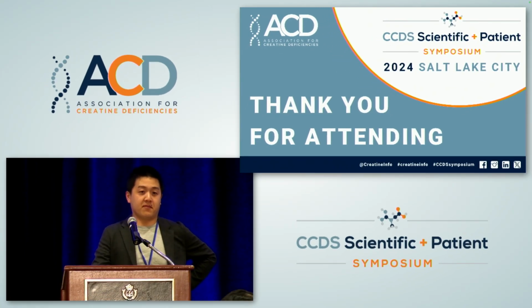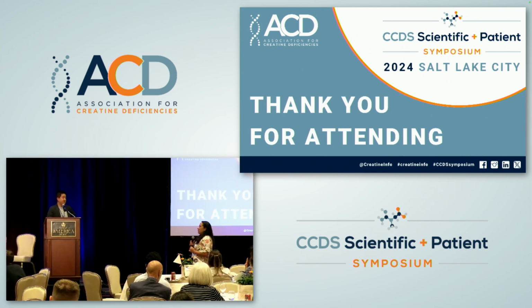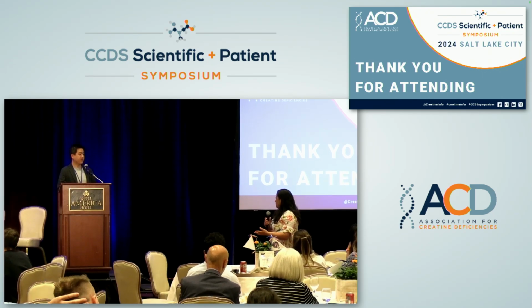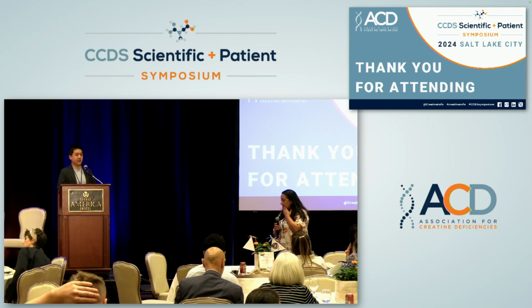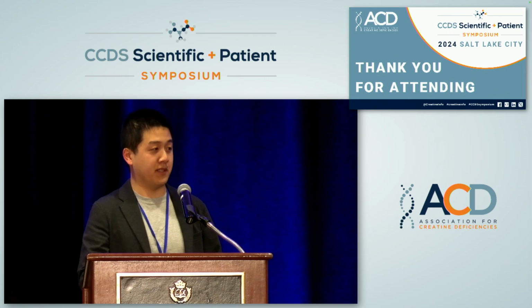Thank you so much for that presentation, and I don't see any hands up yet, so I do have a couple questions. I think earlier this morning, one of the things that was brought up for the newborn screening panel is problems across different instruments, right? If this is mass spec with isotope, I'm assuming this could be applied across different types of mass spec instruments in theory? Theoretically, yes, you should be able to do it as long as you calibrate the instrument properly and you know how to detect the compounds.